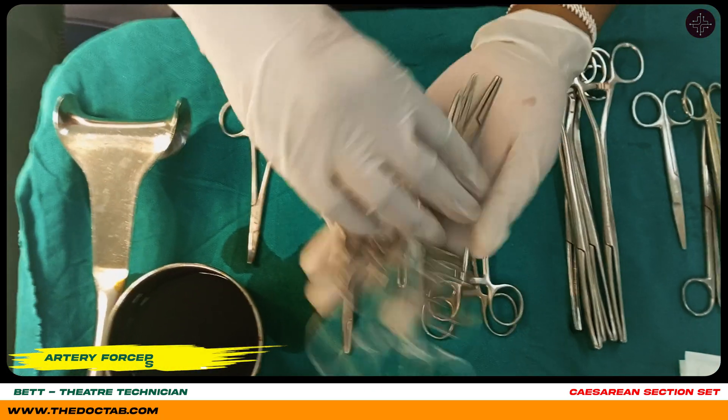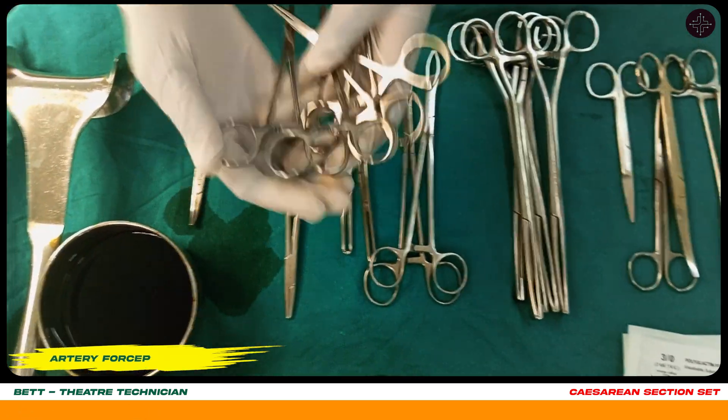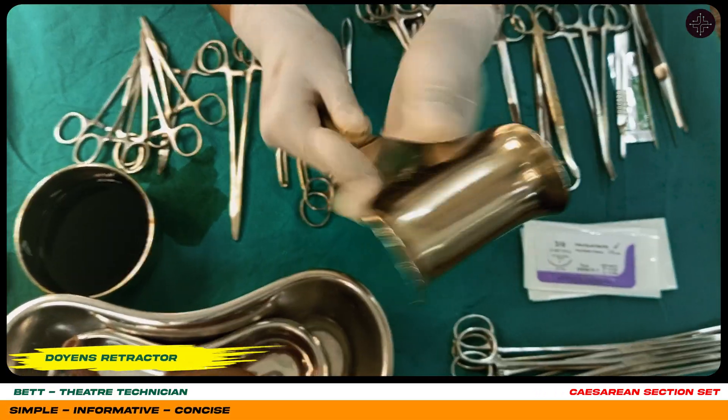Here are our little artery forceps. They are used to prevent bleeding. And this is a Doyen's retractor.